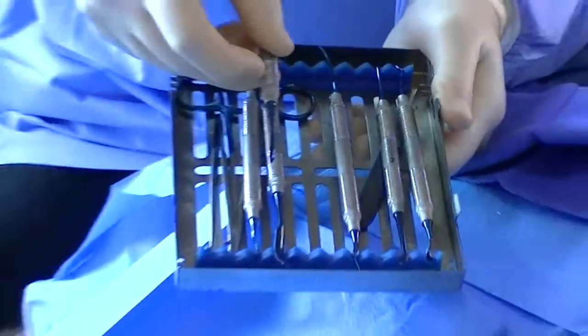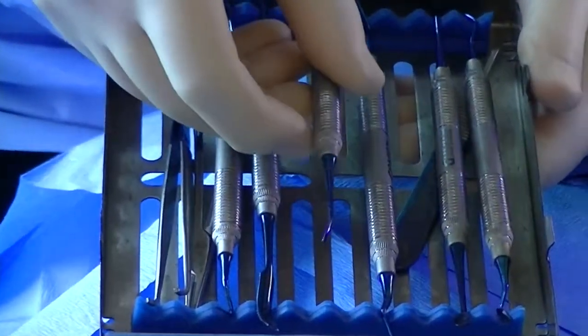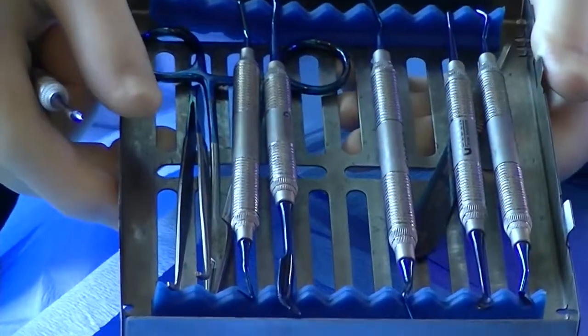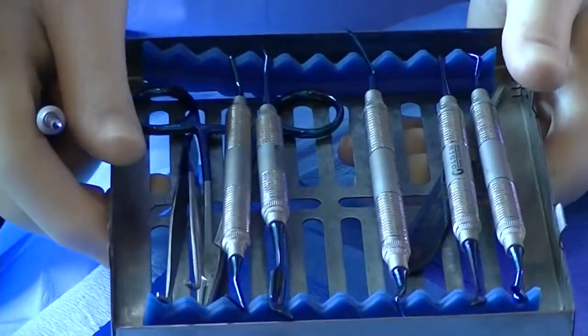And I was talking to you earlier about the grafting kit we created. This is a nice grafting kit, relatively inexpensive, and it has all the apparatus that you'll need to be able to do your surgical reflections and grafting procedures.